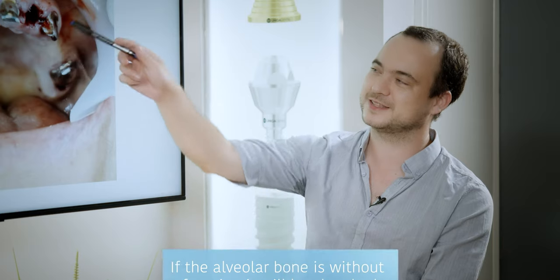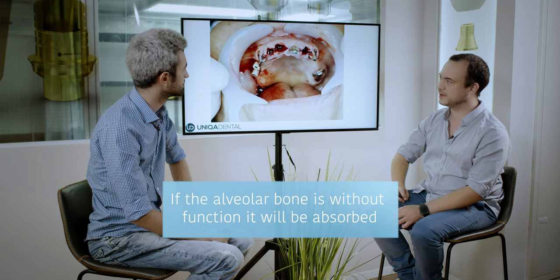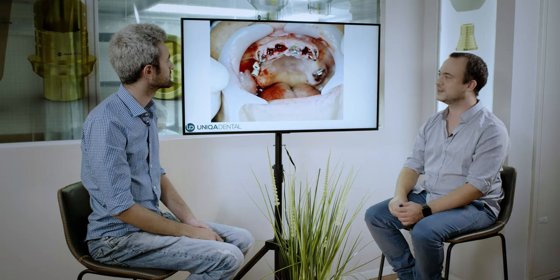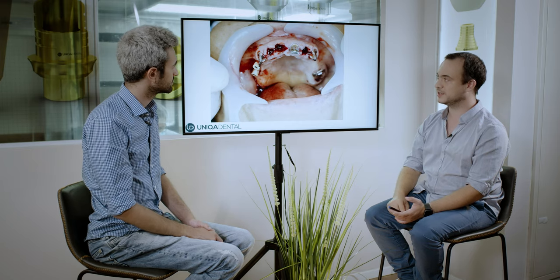This is after the extractions — you can see the sockets. The extractions were made very carefully so that the teeth that were temporarily cemented with the bar didn't move at all. Now you can place the surgical guide and place the implants.